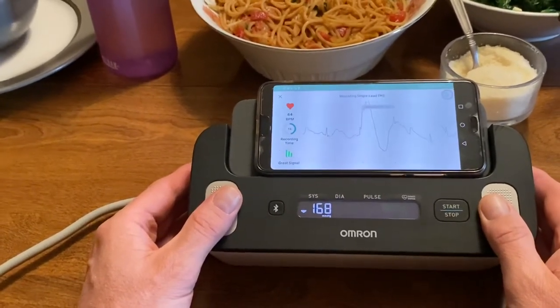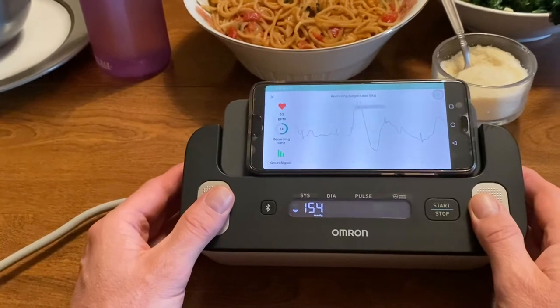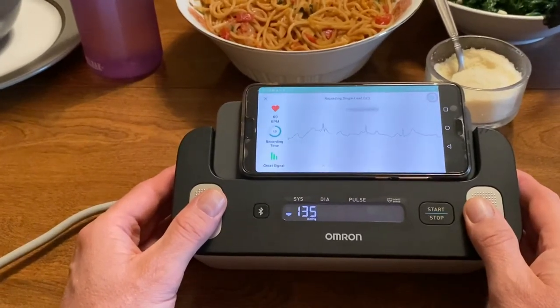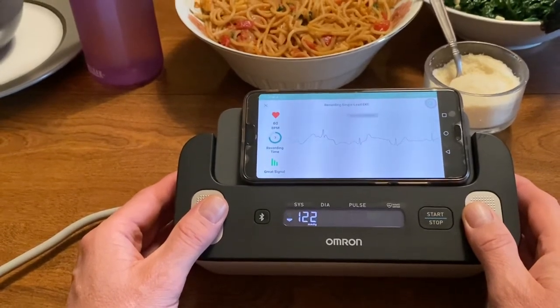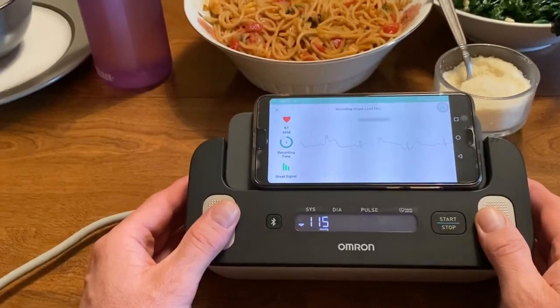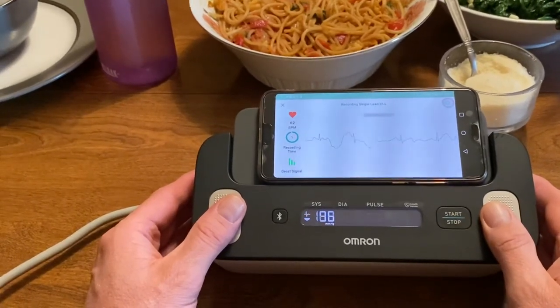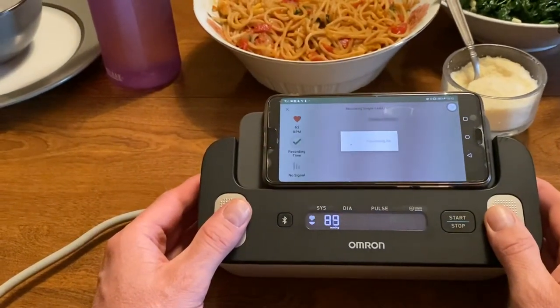You can see that the EKG is underway and my blood pressure is also being taken at the same time. The reading is now complete, and it will ask me at the end of this process if I'd like to have the reading sent on to a medical professional. We've done this in just a little over one minute. Not bad.